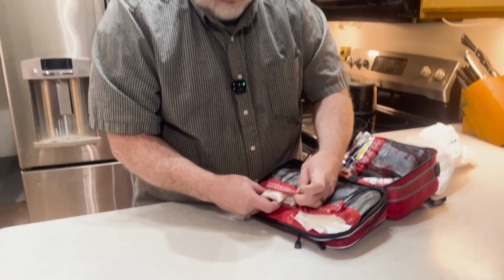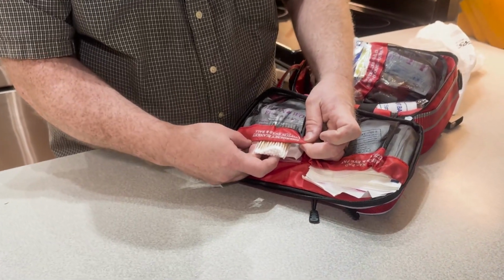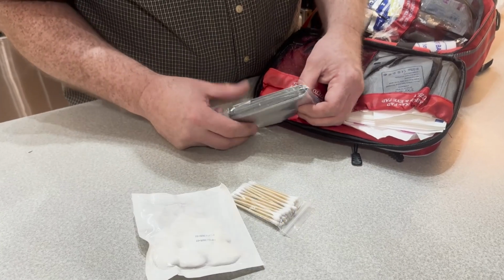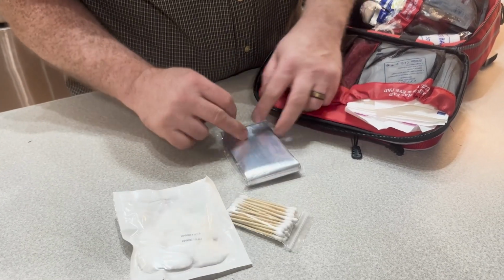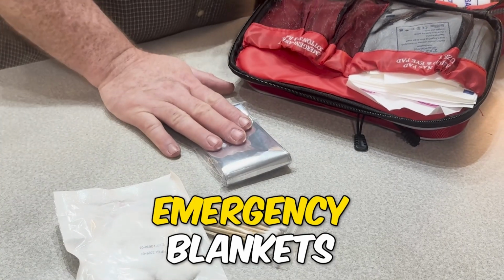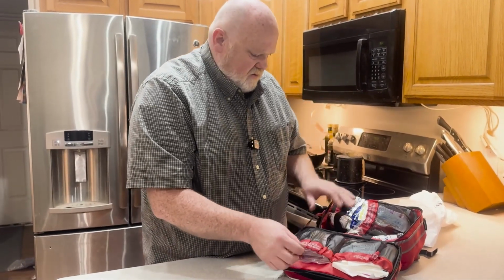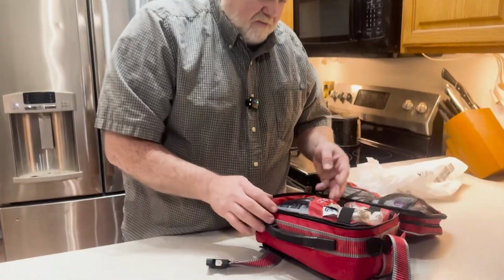And then we've got Q-tips. This is emergency blanket, cotton swabs, and cotton balls. So there's your Q-tips, cotton balls, that's probably enough. And then here's your emergency blanket. That's really good for if they're going into shock. And you have more room to add more of that stuff if you want. There's plenty. So let's get to the meat of this.